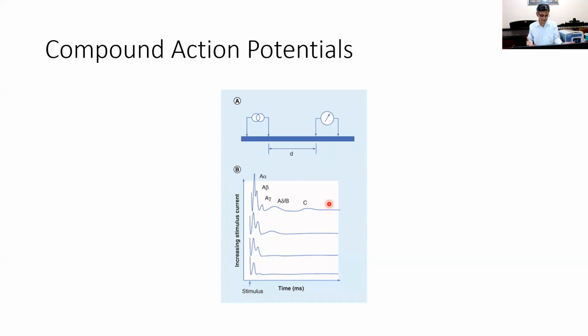You can do it with the patient seated or lying down, it doesn't matter, but you must warn the patient. You will give a small current to your hand, and you may feel it, it may be a little uncomfortable sometimes, a little discomfort, don't worry, and the muscle will twitch. Due to the current, muscle contraction will be felt and seen, right? So this is the same kind of thing recorded beyond this point.